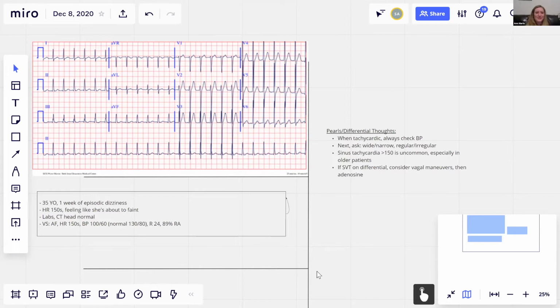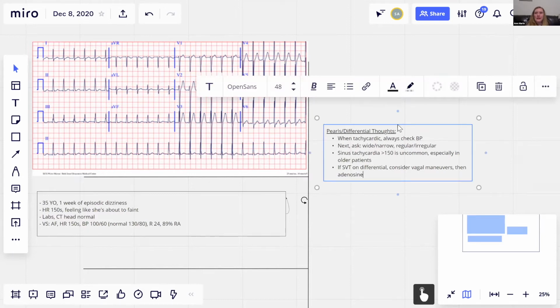Sorry. So when I'm called to the room in this situation, a rapid response comes overhead. The first thing I usually try to do after getting vitals is to go ahead and get the monitor and the Zoll patch and everything on, just in case things deteriorate. We have everything hooked up, and that also gives you another way to check the monitor, to see the rhythm.